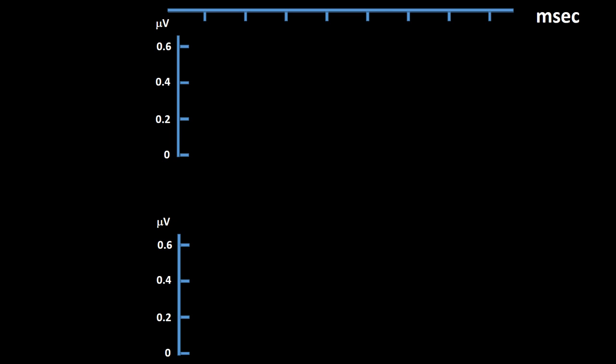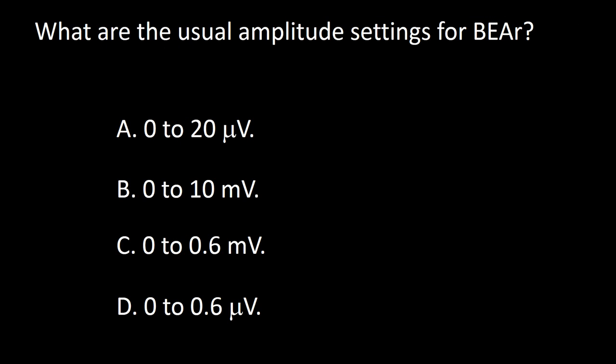In this new frame, I have added two relatively small lines indicating microvolts. As you can see, I have set the polarity to be plus on the upside. In this frame, you can see the montage that I will use very often for the rest of this presentation. Remember that the ground, not presented here, is located at Fpz. So the answer to this question is D.